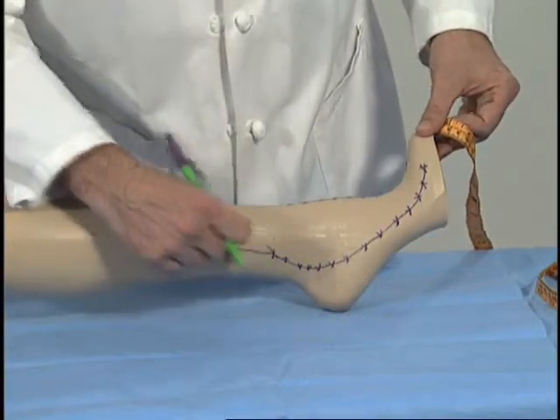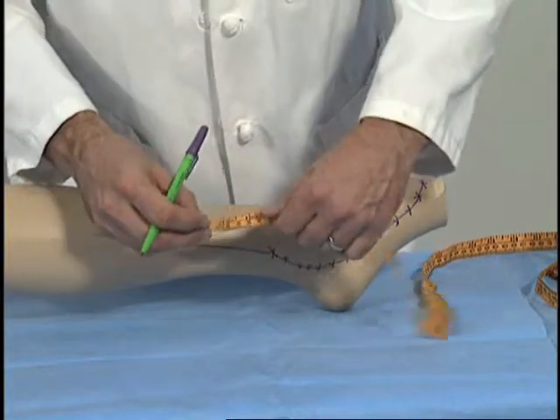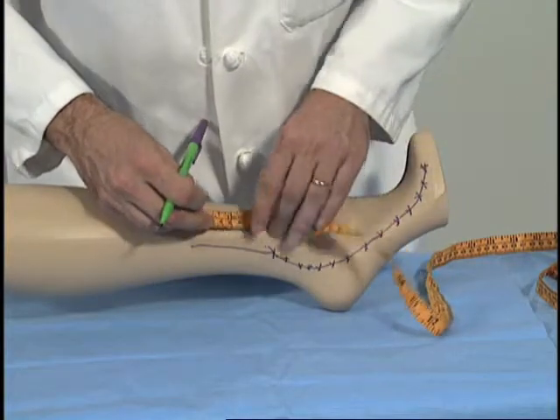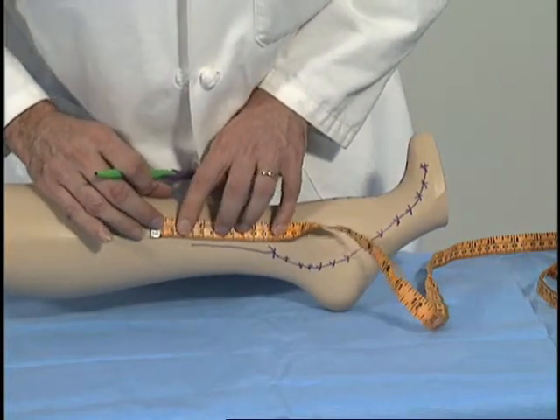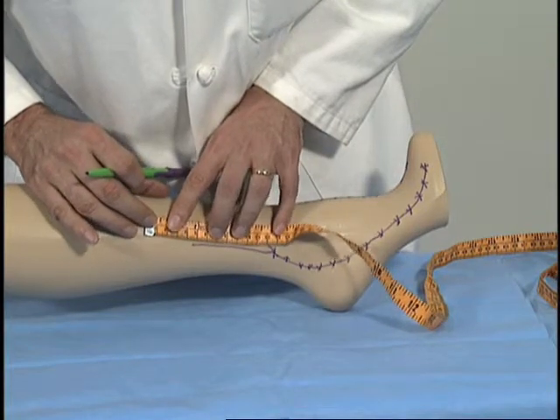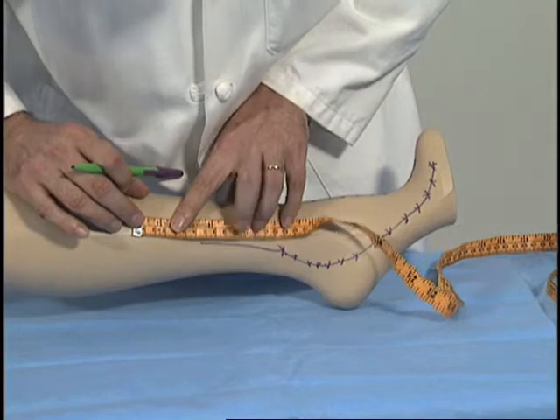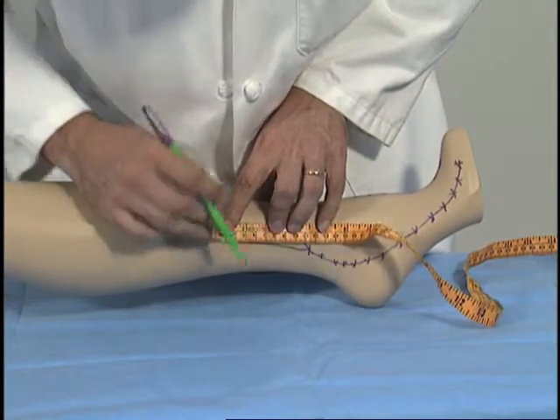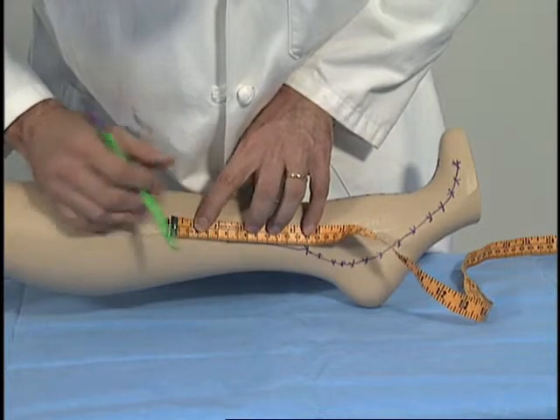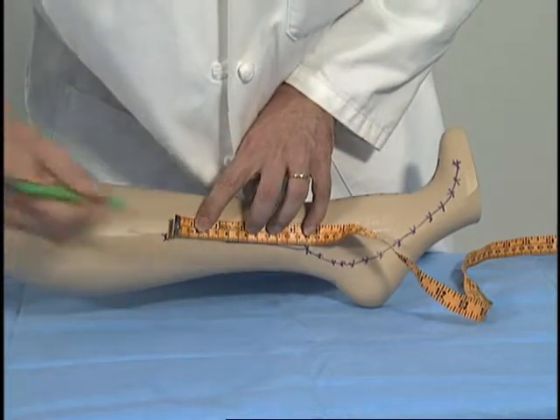We're going to come along the posterior tibial distribution as we discussed, and here you have some flexibility. 7 injections. You may want to spread out to try to get the whole posterior tibial distribution. We can spread it to 2 centimeters per injection, which will get us pretty near the end of the tibioperoneal trunk.